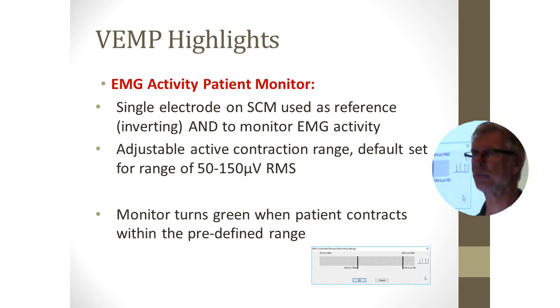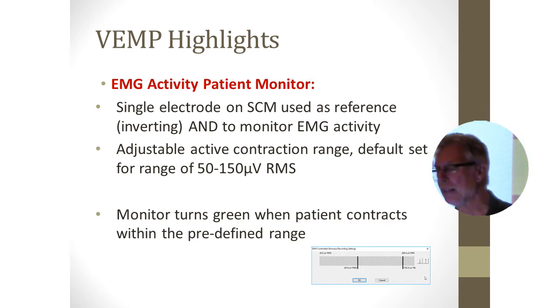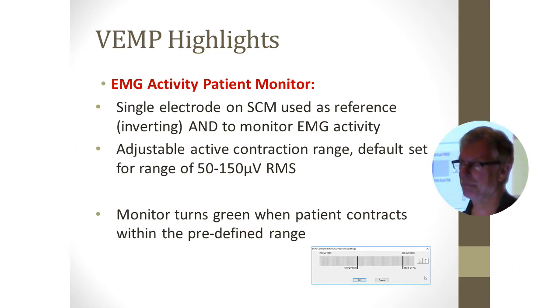And we tried all kinds of different ways to do it. Have the patient turn their head like this. Okay, that's fine. But what if they do it on the other side and they do better when they're facing right than they do left? Neil Shepherd told me one time, take a blood pressure cuff and have it on the patient's hand and have him push his face against his hand and actually read the meter, and the meter would have to be at 30 or 40 or something like that in order for the patient to know he's applying enough pressure. So we've tried all of that, and none of that has really worked.